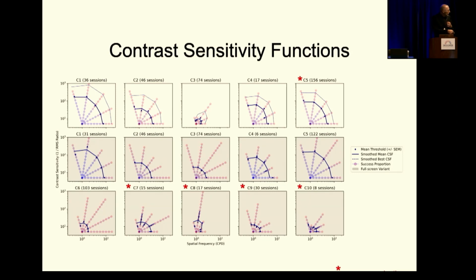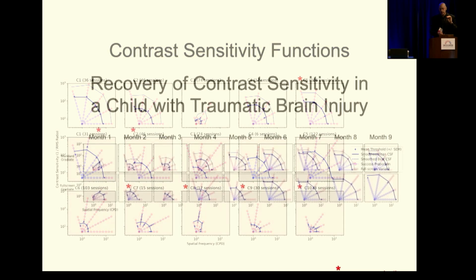And so these two top rows here just show that whole field one with those kind of dots moving versus the one on top, which is the ball movement one. But basically you end up with these arcs, and the distance on the arc and how far away from the zero point in the corner you are tells you how well you see at different scales. And so we can measure these highly difficult to measure things in children.